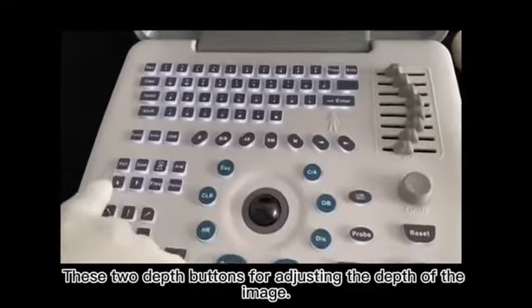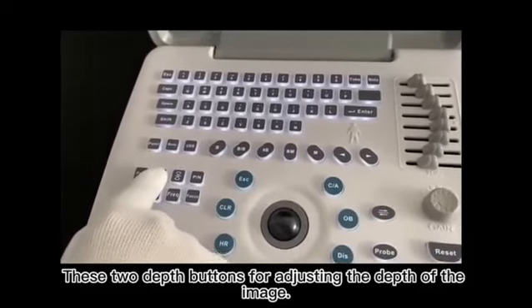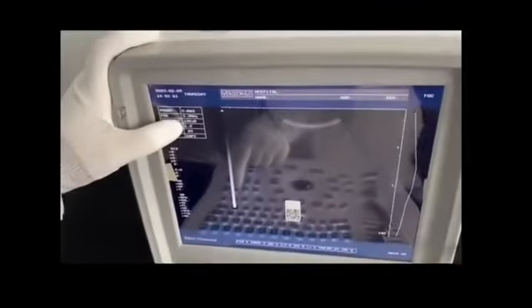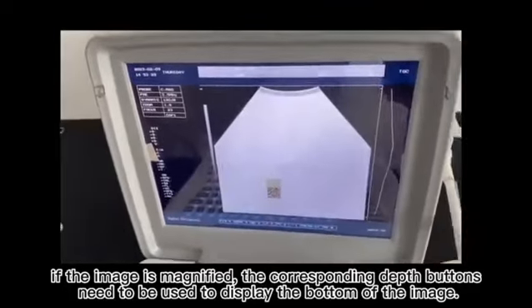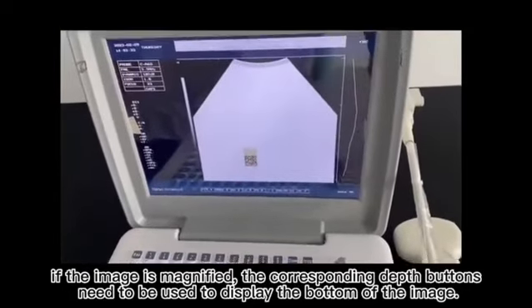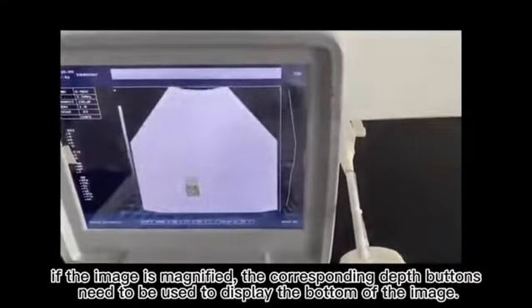These two depth buttons are for adjusting the depth of the image. If the image is magnified, the corresponding depth buttons need to be used to display the bottom of the image.